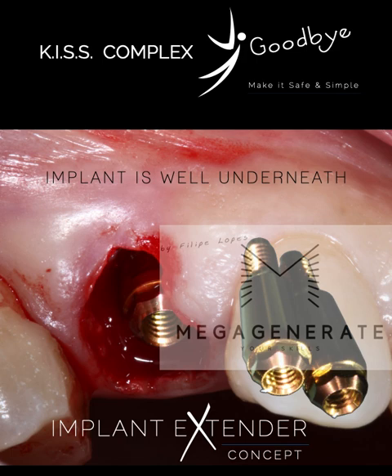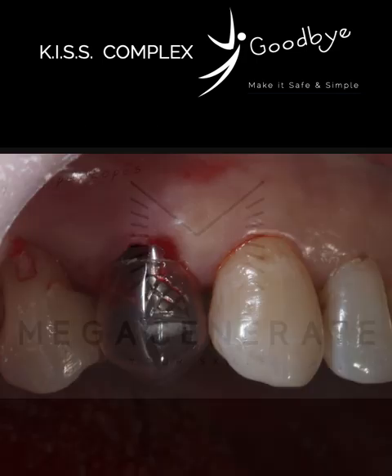Then you can also think about putting in a surgical abutment, the implant extender concept. You put your immediate implant in, and then you extend your implant with a special surgical abutment, and you can see that your implant will be well underneath the gingival level, and many times not just the gingival level, but also the bone level.